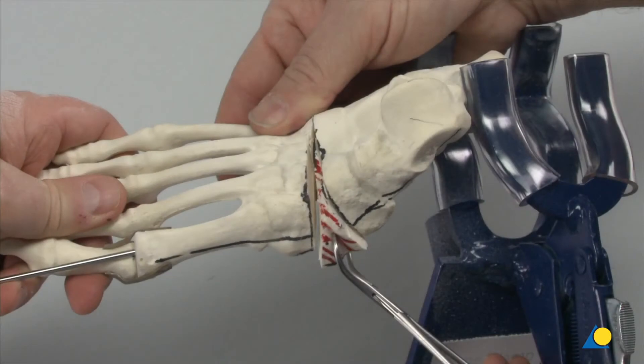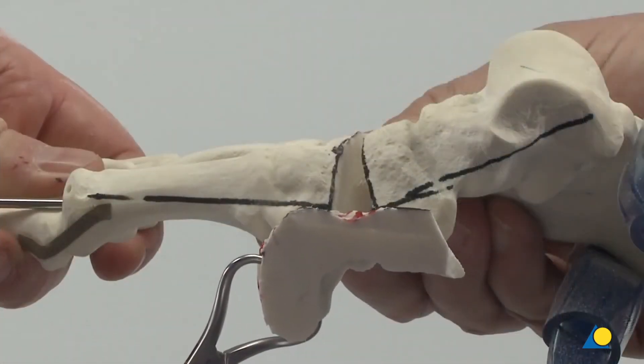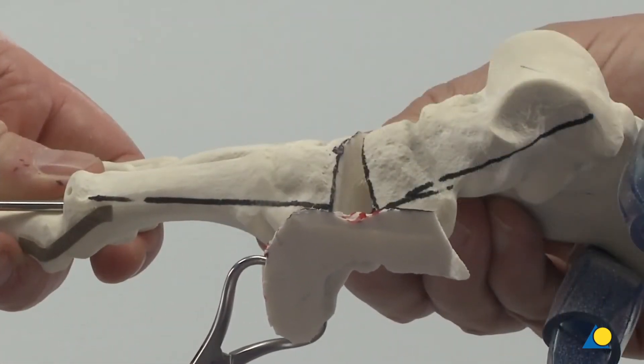The wedge of bone, which includes the damaged articular surfaces, is removed. This bone can be very useful as a source of bone graft.